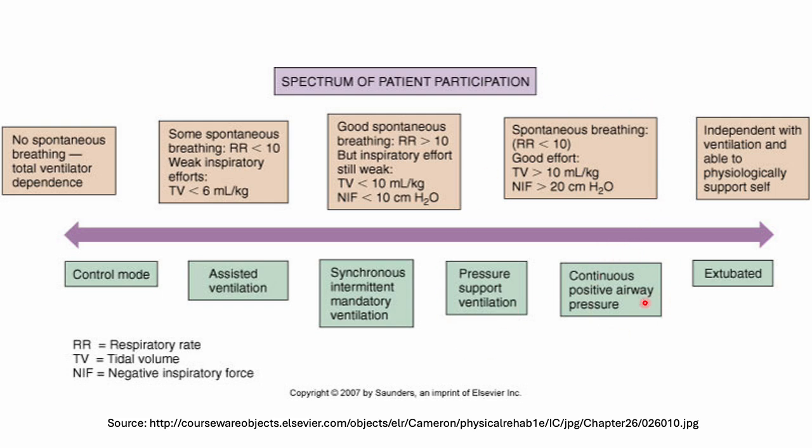But as I mentioned before, in adults, usually no CPAP. It's PSV and then straight to extubation, which is removal of the artificial airway, and then removal of the mechanical ventilator.